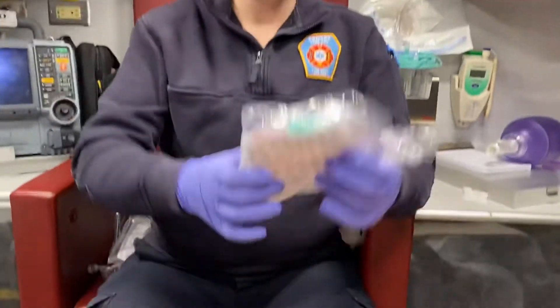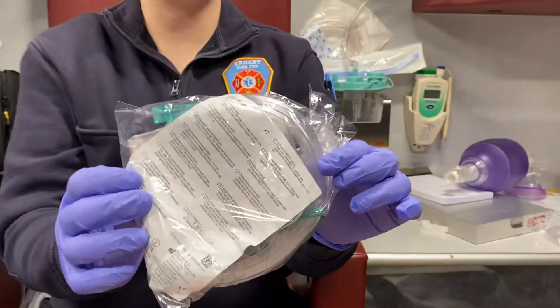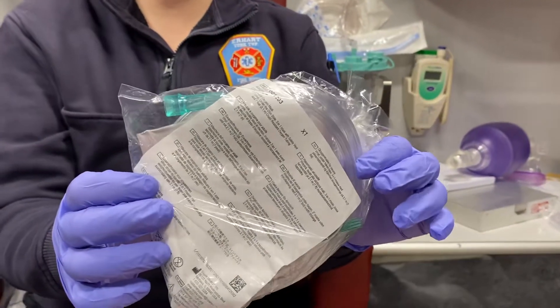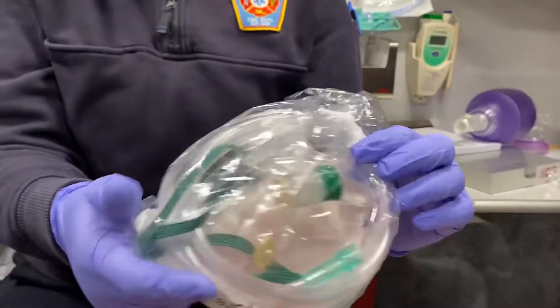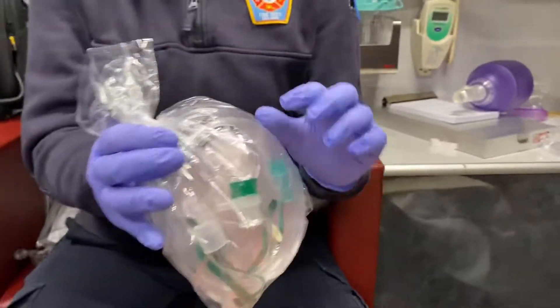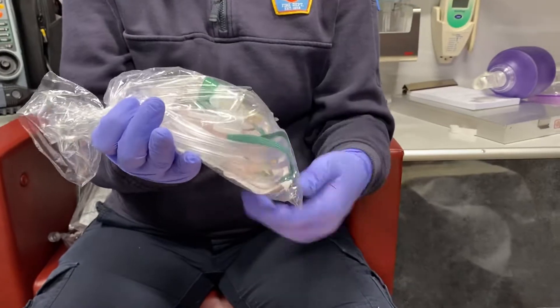Next we're going to talk about non-rebreather masks. Your non-rebreather masks should come packaged. Just make sure you have the adult — the pediatric bagging looks very similar. It should be concealed; you should have your oxygen tubing, your mask, and your reservoir bag.